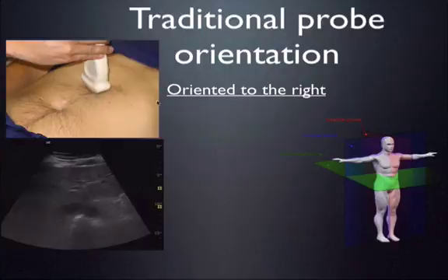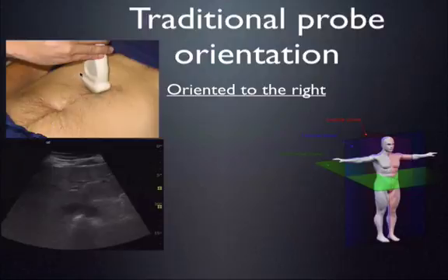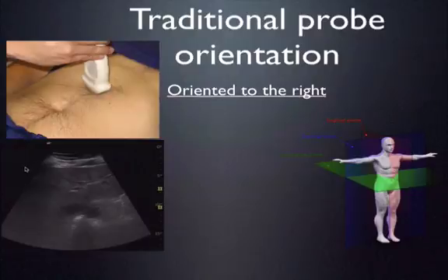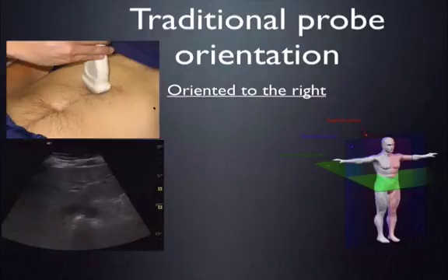In a transverse axis view, the probe indicator points to the patient's right. The corresponding image shows the GE marker on the left side of the screen. Because the probe indicator points to the patient's right, the left side of the screen correlates with the patient's right side, and the right side of the screen correlates with the patient's left side. Looking at two vessels with the spine visible, we're in a transverse plane viewing from the feet toward the head.